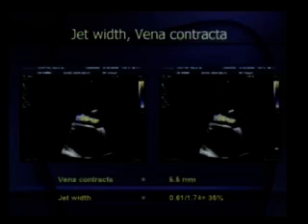The idea here was not to dishearten you or to give too much data, but really to give you good insight into how you can use echocardiography. But again and again we keep coming to the same theme, that clinical examination and good history taking are absolutely mandatory to send a patient up for surgery or to keep him in medical follow-up. See, echocardiography is not about a lesion. You're not going to say that if there is aortic regurgitation, you will not comment on other valves or other structures.